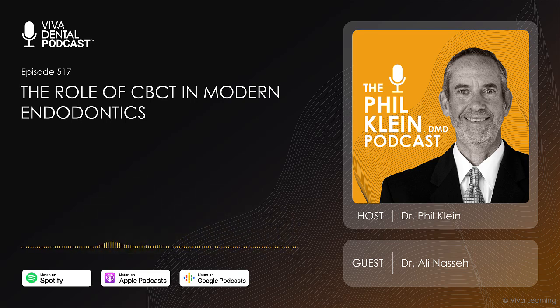It looks like a beautiful root canal, but you have a whole other lingual root canal that hasn't been treated, or has a big isthmus, and the bacteria from that is causing the failure. That explains a lot of these things now ahead of time. So you can go ahead and treat that non-surgically, retreated, as opposed to going in there and doing apico, which we used to do before, and then the apico would fail, and we would say, oh, apicos don't work. But it helps improve the success rate of apicos even, because you apply it only in those cases where it should be applied. Yeah, that is so logical, what you just said.